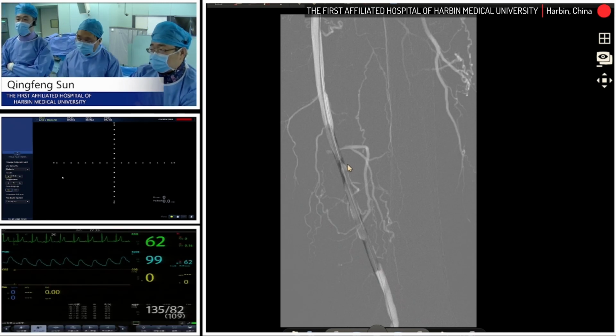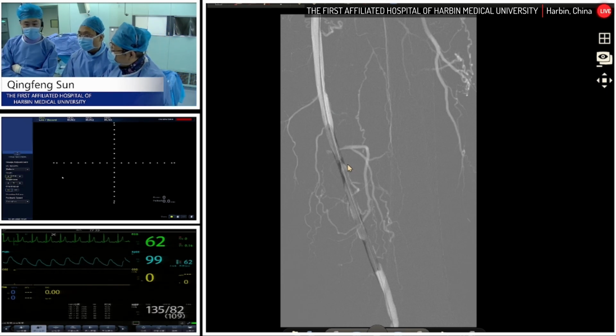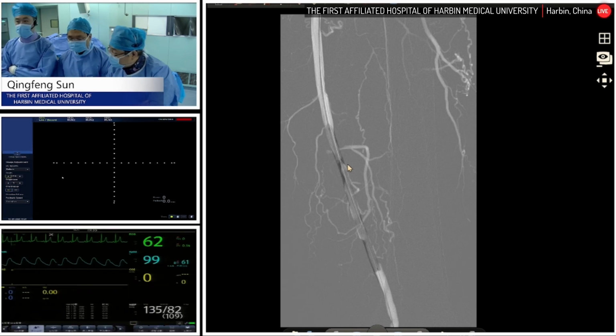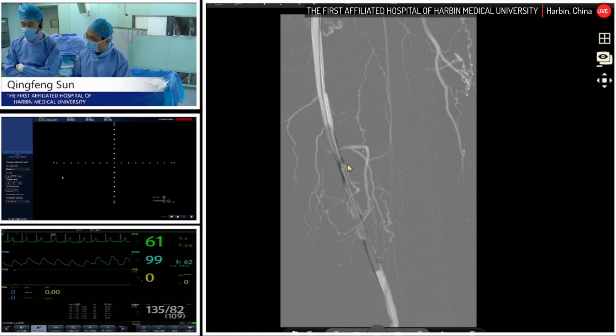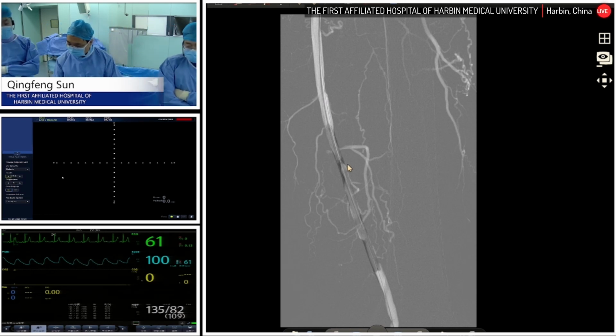We finally use the 6 millimeter balloon for the final. So it's 2 minutes. All right, 2 minutes. So we are planning to use 3 diameters: first 4, then 5, and 6 for the graded dilation, and we'll see the final angio. And of course we will use IVUS again to see if there's some different kind of dissection.